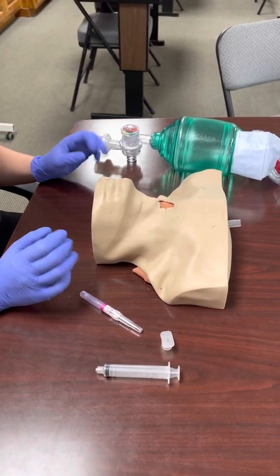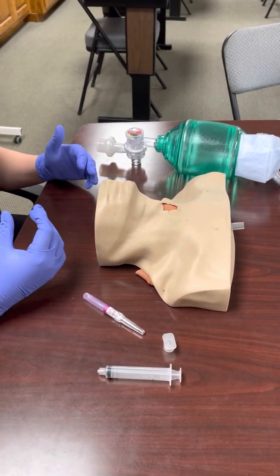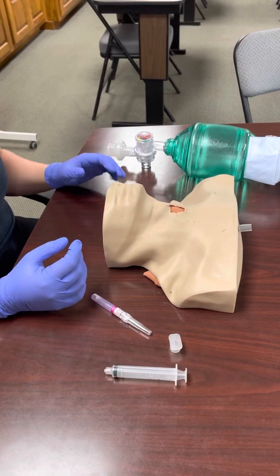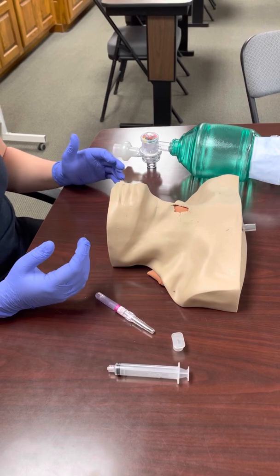In this video I'm going to demonstrate a needle cric. Needle cric is in the protocol where I work, preferably for children. We'll kind of see why when we hook up the BVM — there's not a whole lot of oxygen delivery for our adult patients. We prefer to use the QuickTrack or some kind of cric kit.